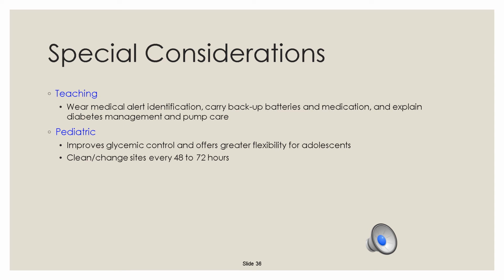Pediatric patients. This is great for diabetic pediatric patients. It gives them more flexibility and gives the patient responsibility for the diabetes management. But they need extensive education.